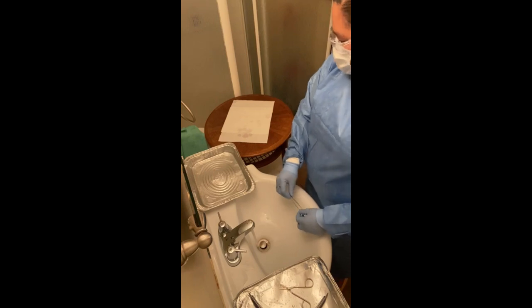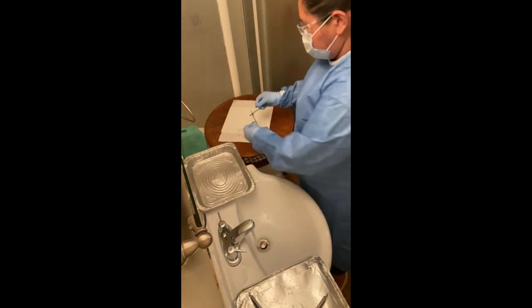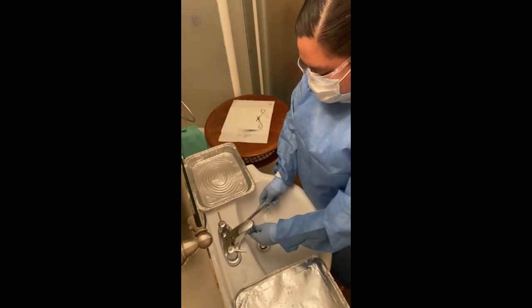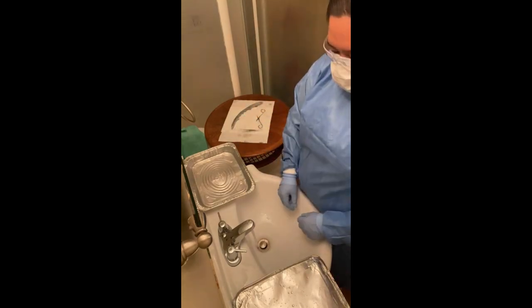Rinse the instruments with clean water to remove any soap or cleaning solution residue. This ensures no chemical residue remains on instruments, which could interfere with disinfection or sterilization.